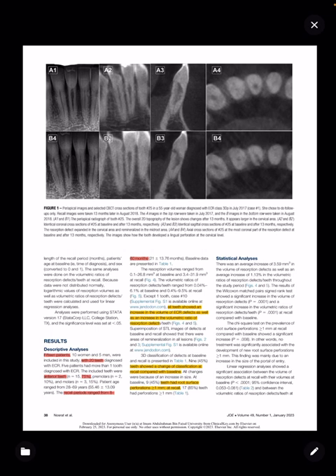For the results, after reviewing CBCTs of 15 patients with 20 teeth, mostly anteriors, at baseline and recall, period of 8 to 60 months, the authors found: 1. All teeth showed an increase in the volume of external cervical resorption defects, as well as an increase in the volumetric ratio of defects. 2. All teeth showed a change in classification at recall. 3. Significantly more teeth had root perforations at recall CBCTs.